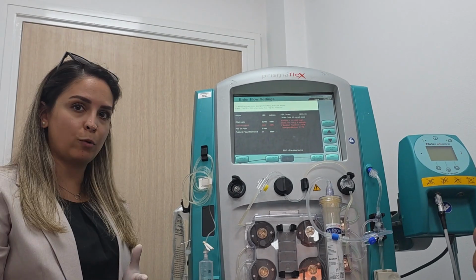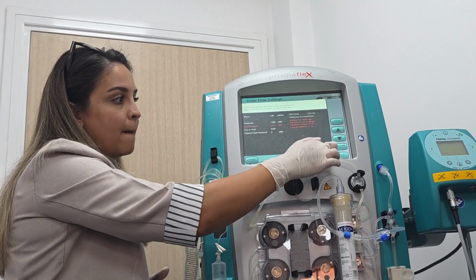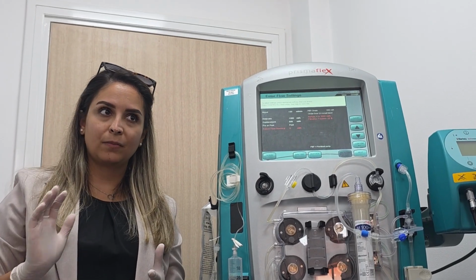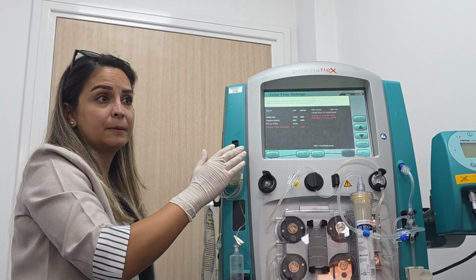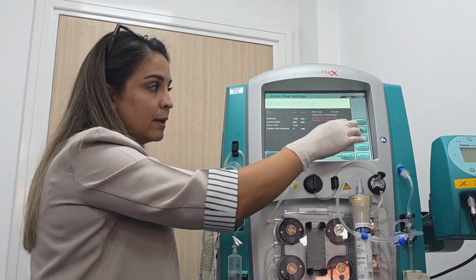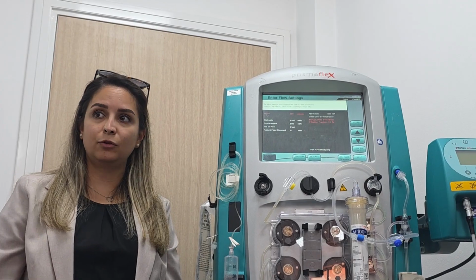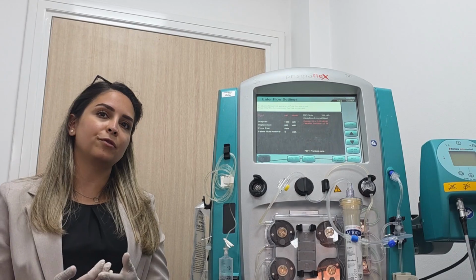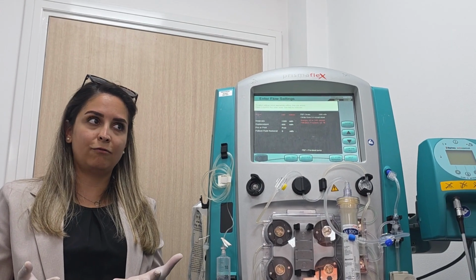There's nothing to change from your side. Patient fluid removal, this is as per order from the doctor. Clear for these? Blood flow, you can start gradually. You can keep it 100 at the beginning because you are starting the session. Later, you can increase it until you reach 130. Still 130, it's nothing for the patient.